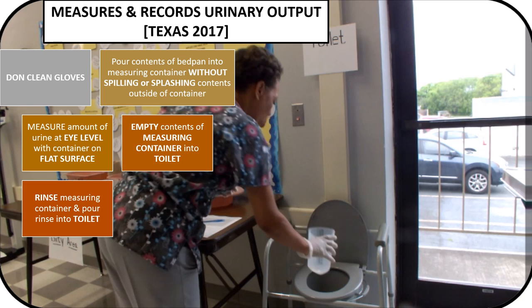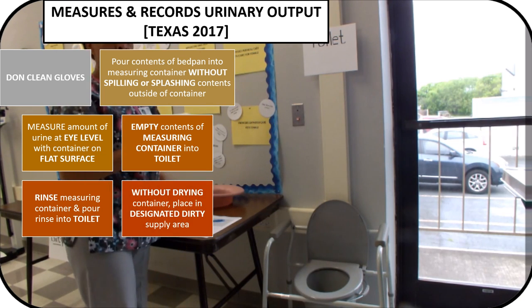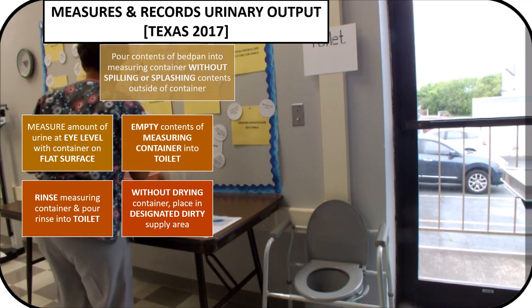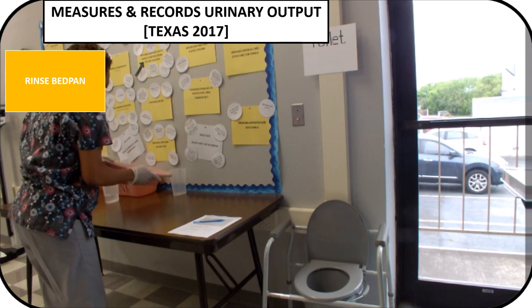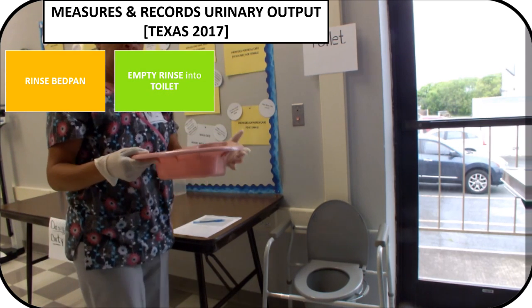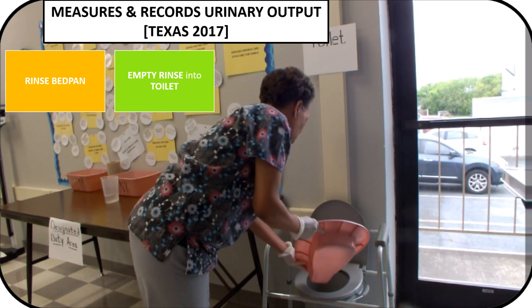The rinse you will pour into the toilet, and then without drying, place the measuring container in the designated dirty area. You will then want to rinse out the bedpan, and also pour the rinse of the bedpan into the toilet.